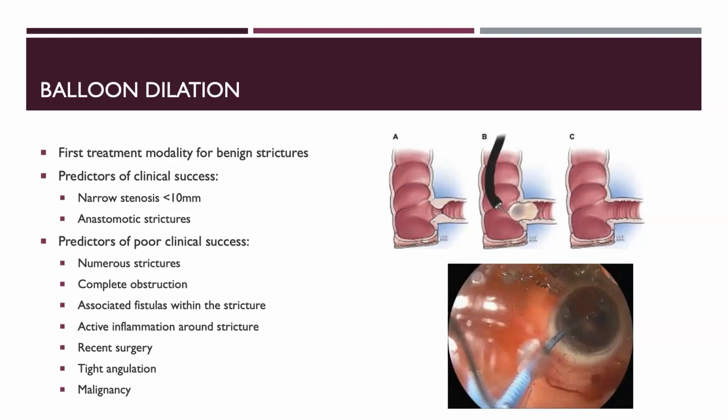I'm sure many of you during your general surgery rotation have seen where people have done balloon dilation, say, of an esophageal stricture, and then it's caused a perforation, right? Because these balloon dilations are not good at giving you tactile feedback when you're dilating beyond a certain point that the lumen is capable of stretching to before perforating. And so obviously when patients have inflammation, the risk of perforation goes up.